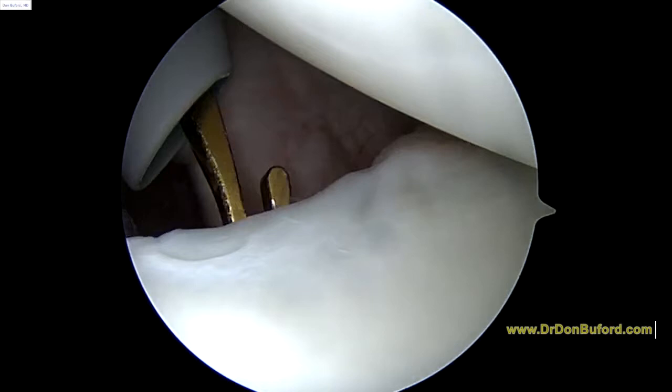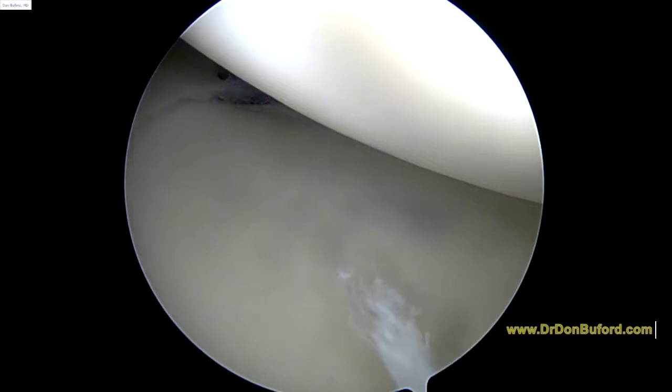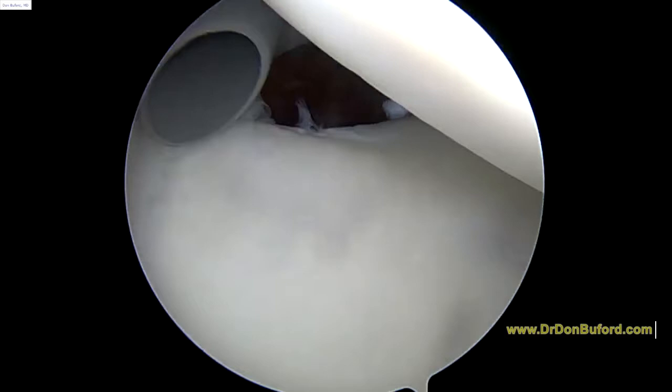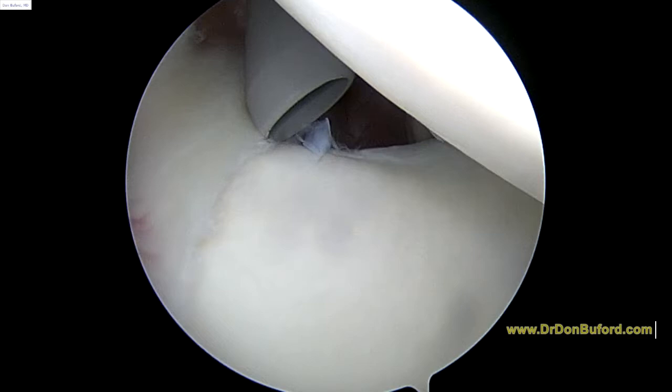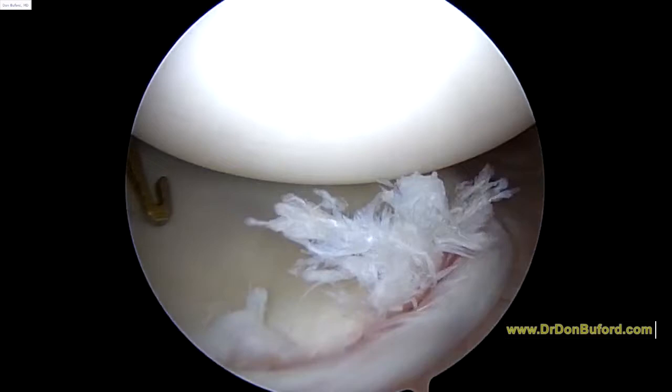But as we look towards the back, I bet we're going to see something that's not normal — and sure enough, this posterior labrum is torn. And part of the problem here is you can see there's not really much of a posterior band of the IGL. So we're going to work to fix this here in just a minute.